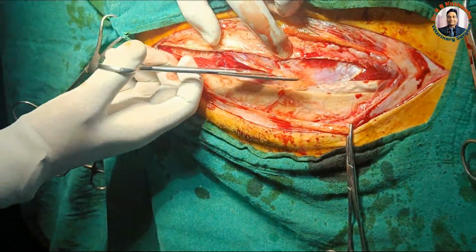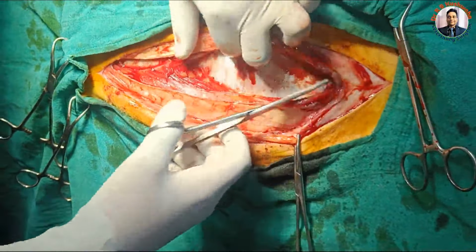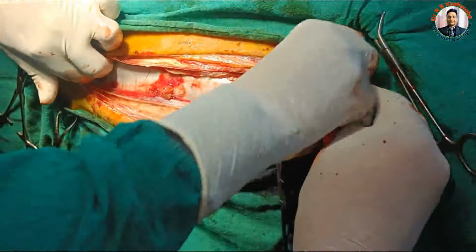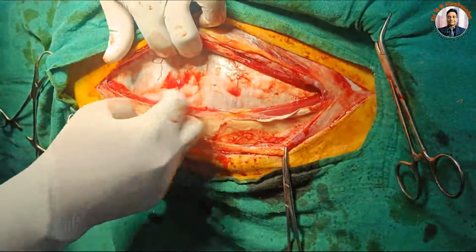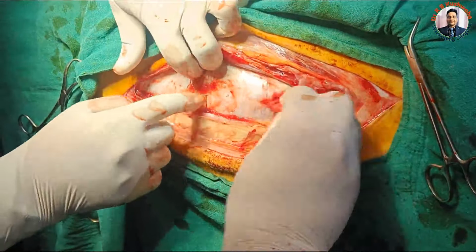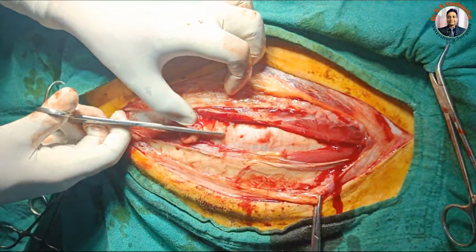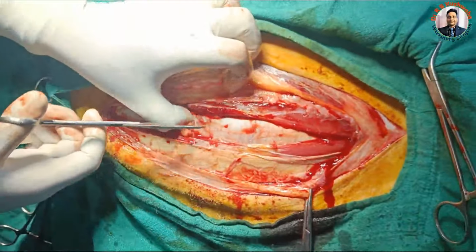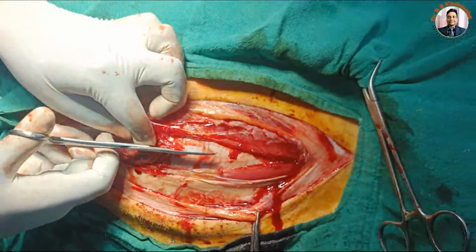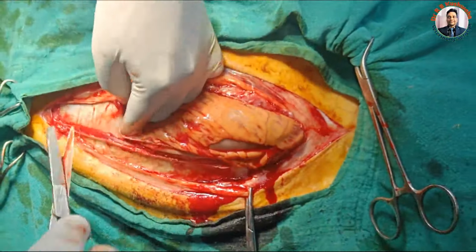This rectus abdominis stretches a lot since there is pressure here. Now you could see this is the peritoneum, and it is slightly punctured while giving the incision. With the help of scissors, we simply cut this peritoneum. So these are the different structures which you have to encounter during the cesarean section.